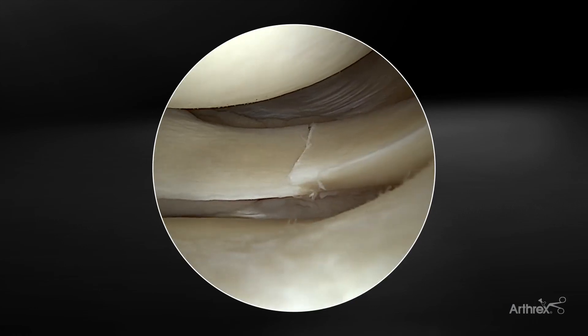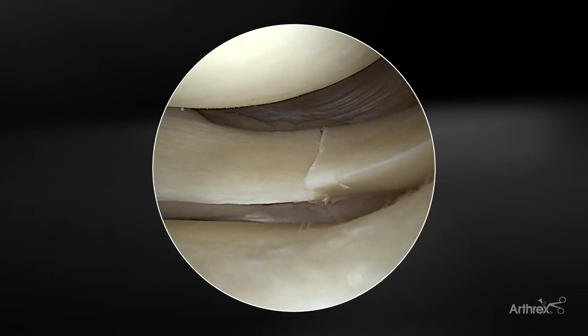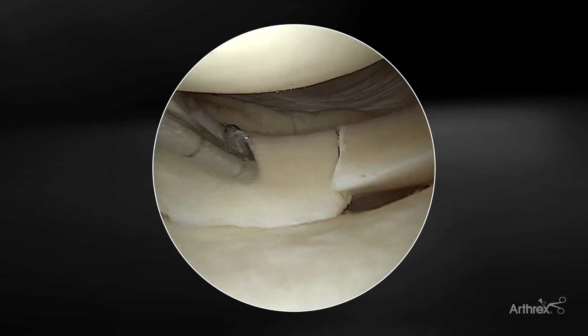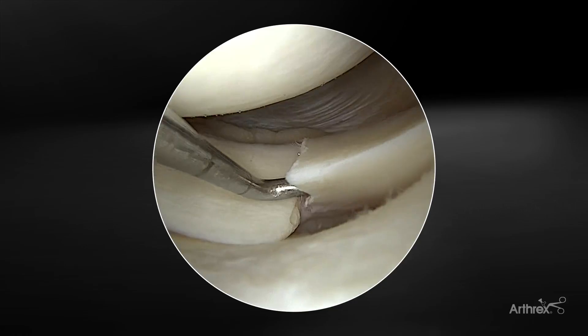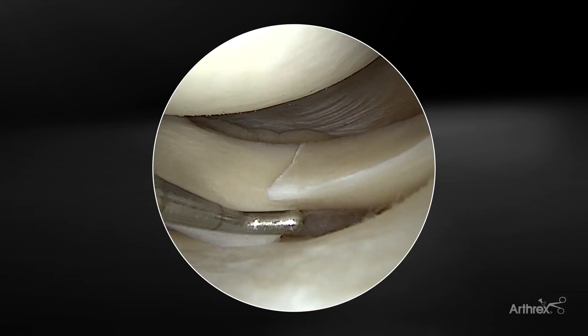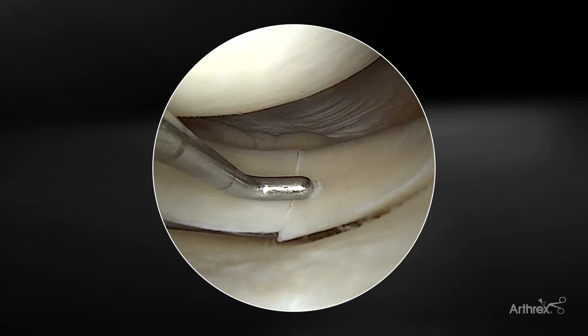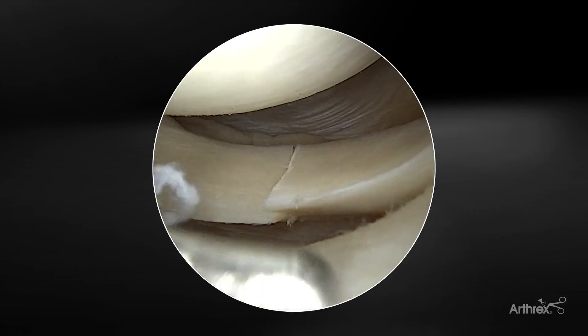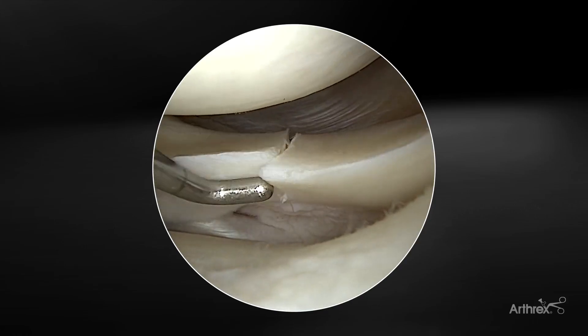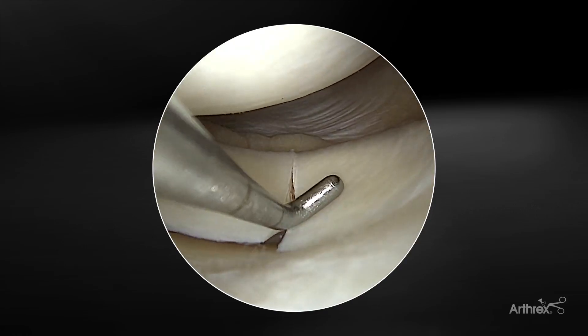This is a right knee. We've created a radial tear at the posterior horn of the lateral meniscus. This is often seen at the same time as an ACL tear in young patients. These can have very frayed edges, so they can be very challenging to repair, but are really critical for the young patient and the long-term health of their joint to get a nice repair.